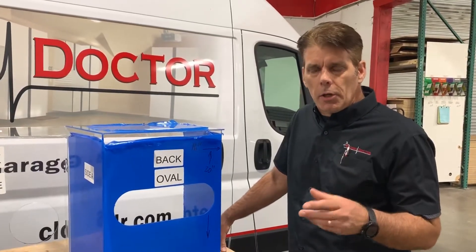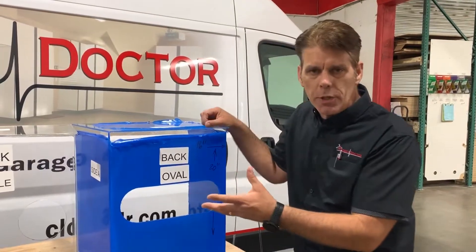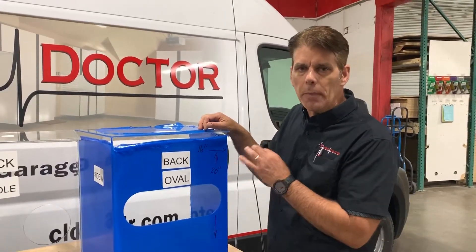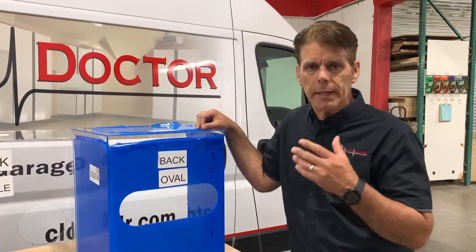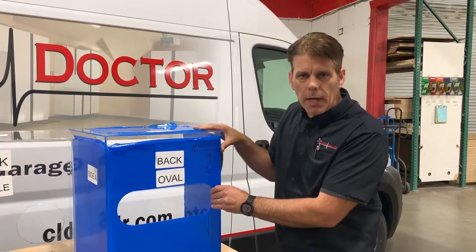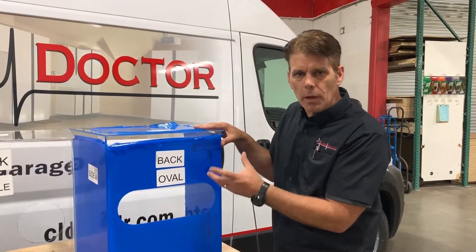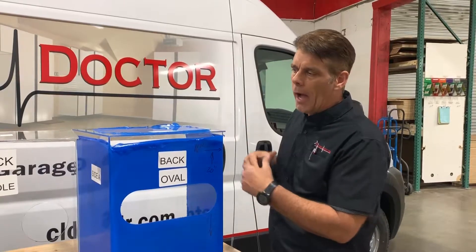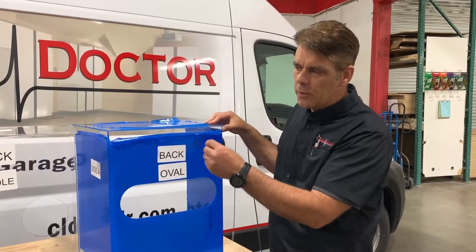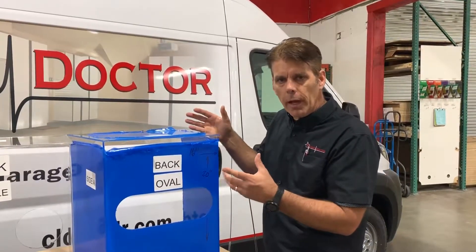Hi there, Derek Holland with The Closet Doctor. I want to give you a brief explanation and demonstration of the aerosol protection shield boxes that we've tooled up in our manufacturing here at The Closet Doctor in Lincoln, California. The original design came from a doctor in Taiwan. I've got friends in Ireland who worked with doctors and anesthesiologists there to improve and perfect it, and we've made a few additional changes here at The Closet Doctor to make it even better.